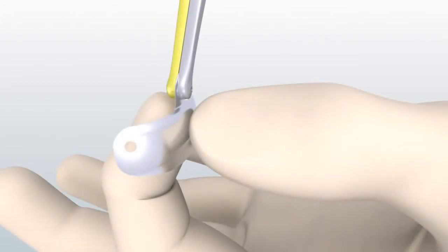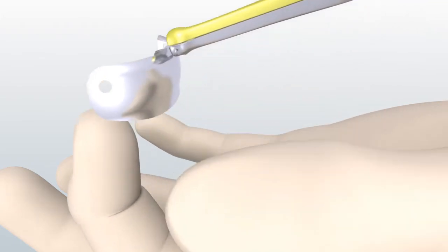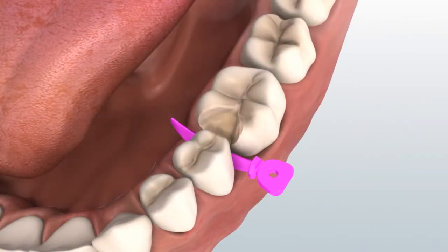Hold the appropriate sized V3 tab matrix with the pin tweezers and bend the tab towards you, creating a contra angle that ensures easy matrix placement in an apical direction. Have the gold side of the tweezer tips, the side with the pin, facing away from the tooth. This way the pin will not hook the tab when you release the tweezers. The following technique makes it impossible to trap gingival tissue inside the proximal box and prevents entrapment of the rubber dam. Slide the matrix between the wedge and the cavity.